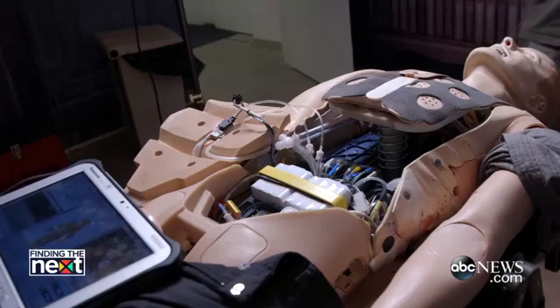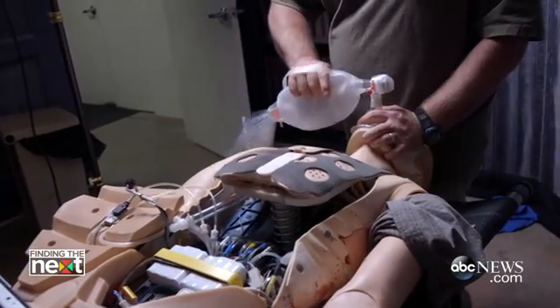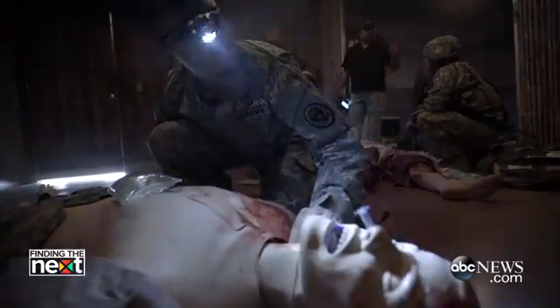One of the biggest benefits our mannequins provide is real-time feedback to the student. I got a strong carotid. Pretty much any intervention you could do on a real person, you can do on these mannequins.